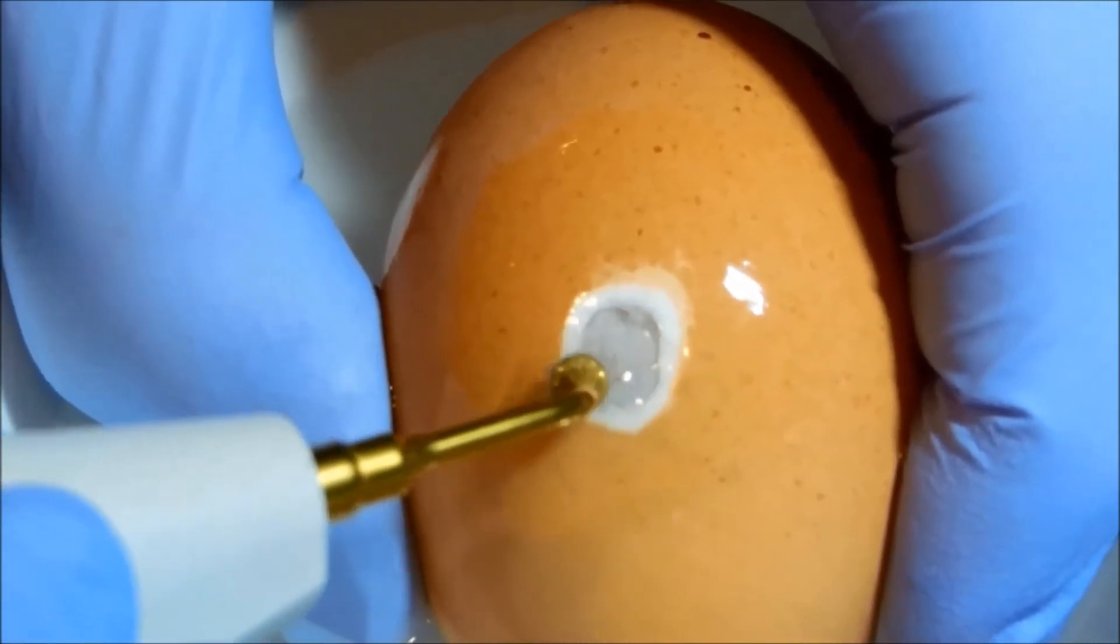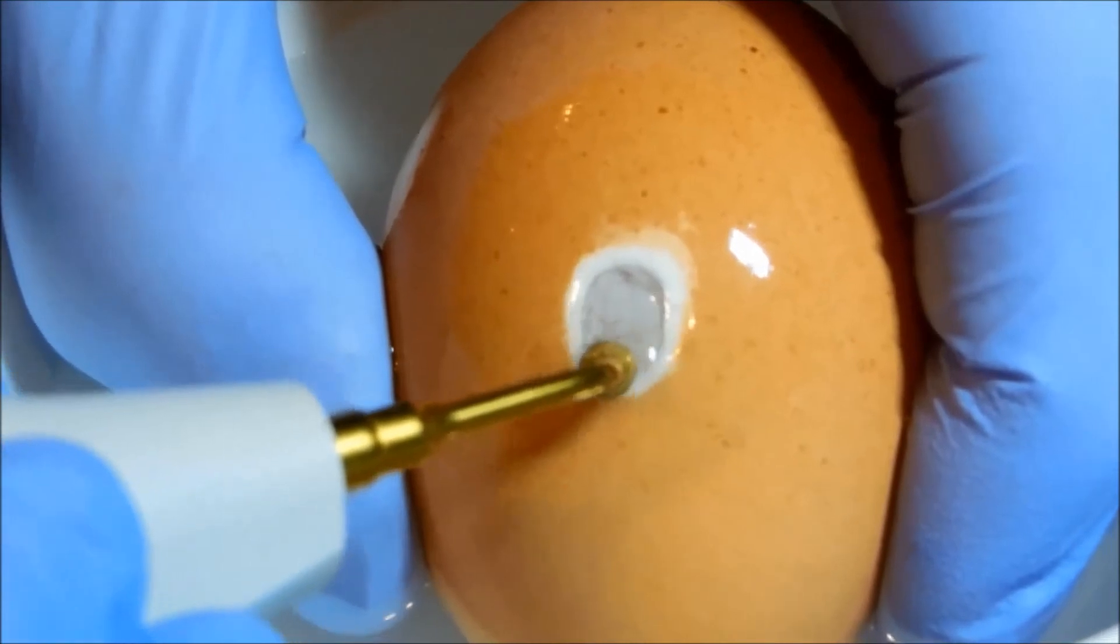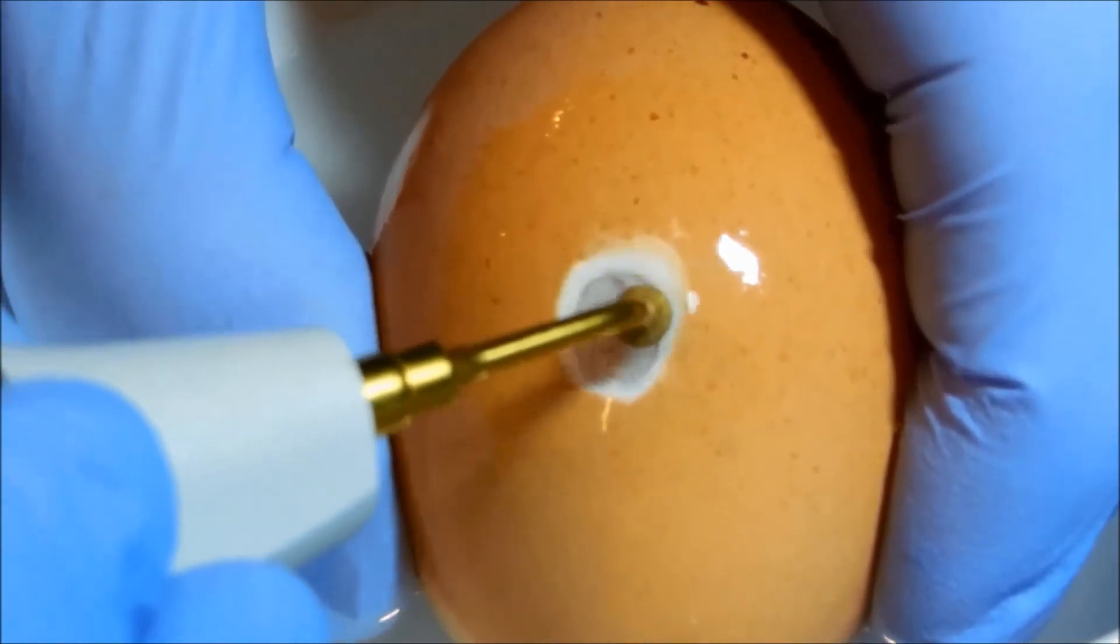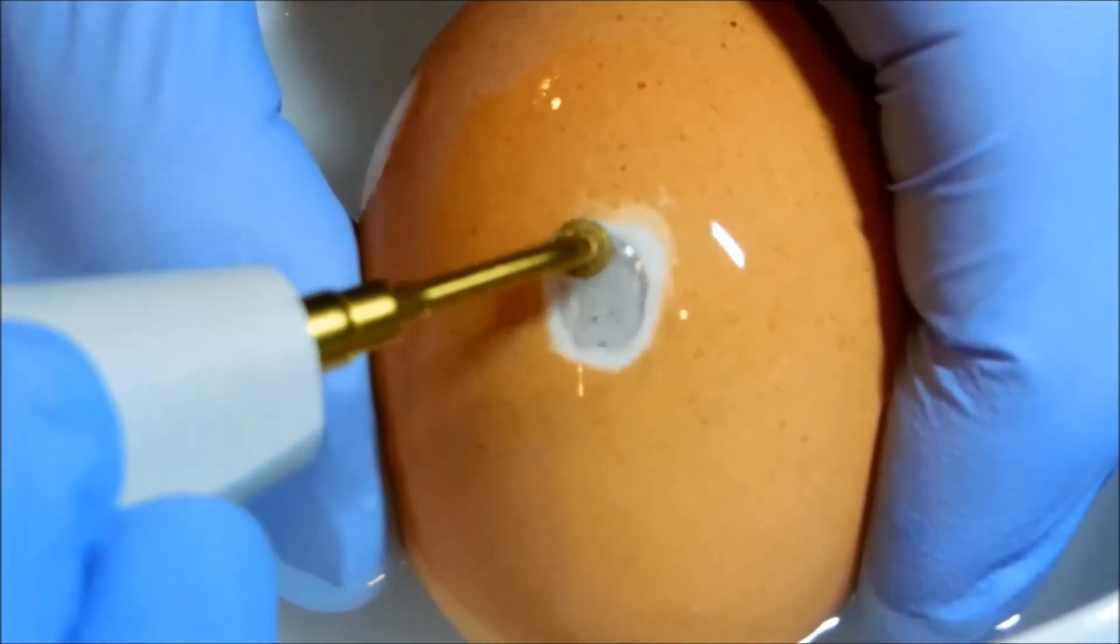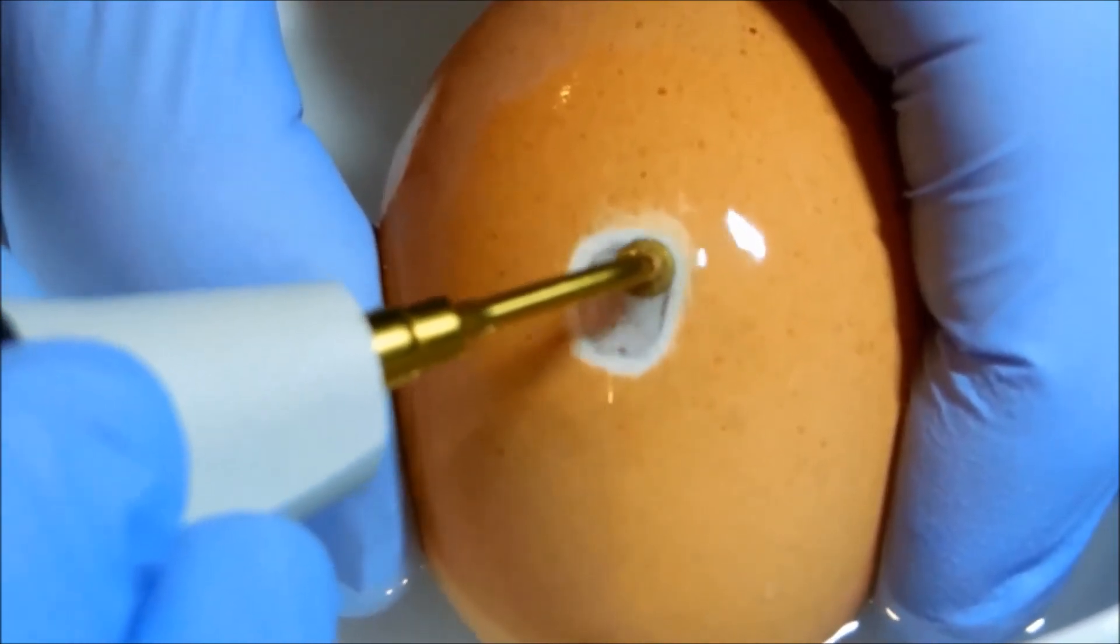And of course we can push against this membrane without any fear, because the movement is specific only to the bone and does not affect the soft tissue—it protects the soft tissue.